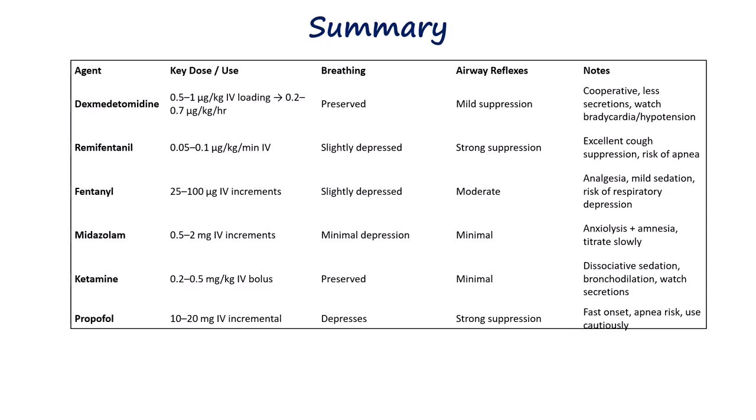What really matters is picking an approach that you can titrate safely. Even more important than the choice of drug are the basics like good technique and maintaining oxygenation. At the end of the day, it comes down to using agents you're familiar with and applying them carefully.